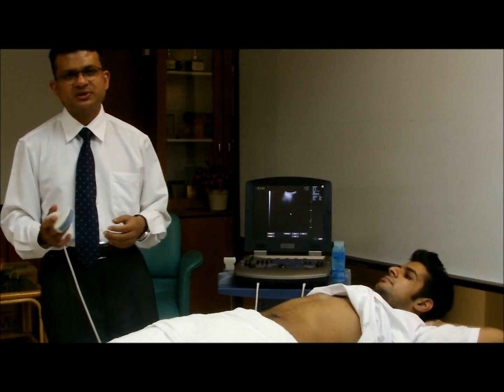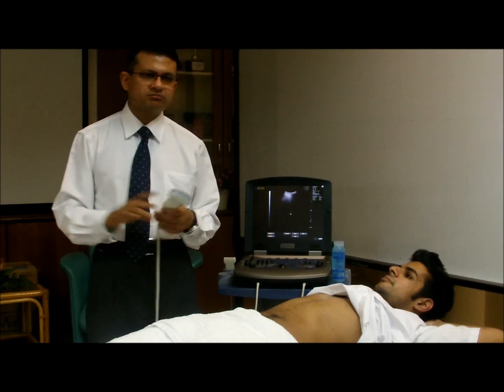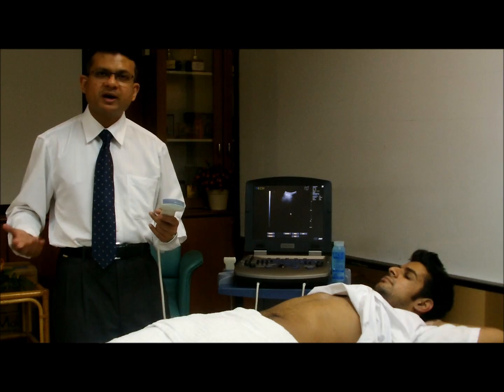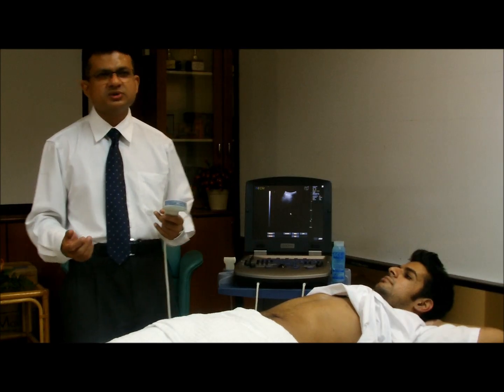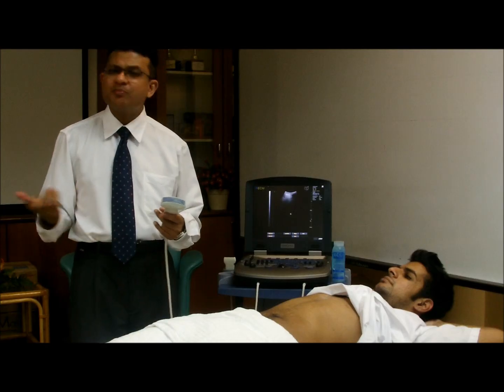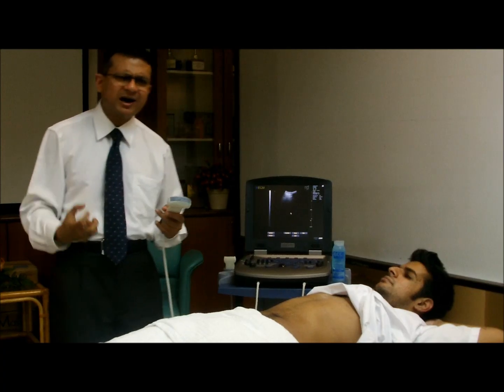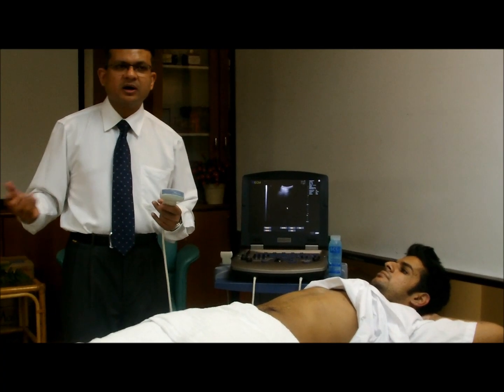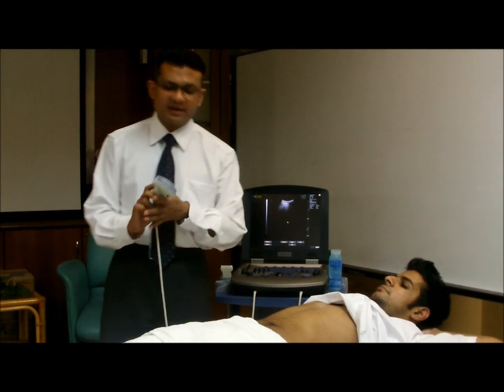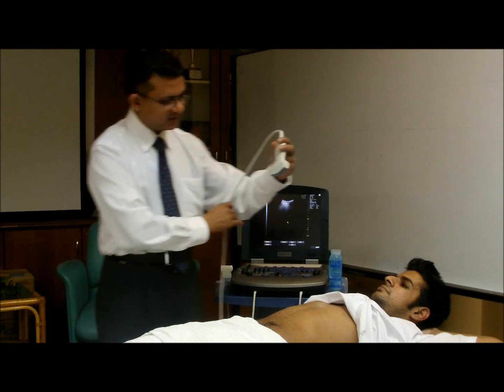You have patients who come in complaining of pain over the right hypochondrial area, or patients who have jaundice, or some patients in whom you're trying hard to look for a source of fever. One of the sources of fever is hepatic abscess. To look at the liver is pretty simple.